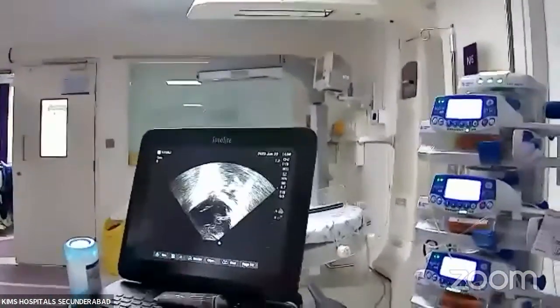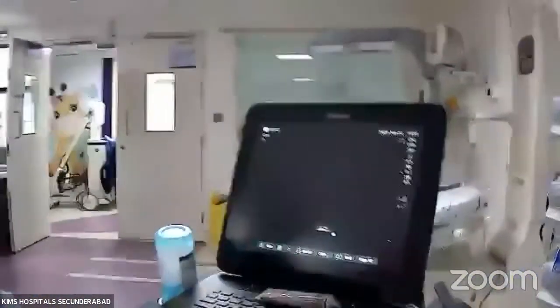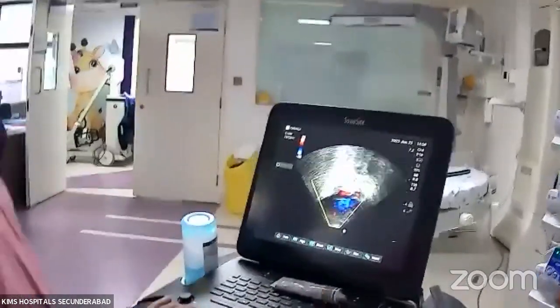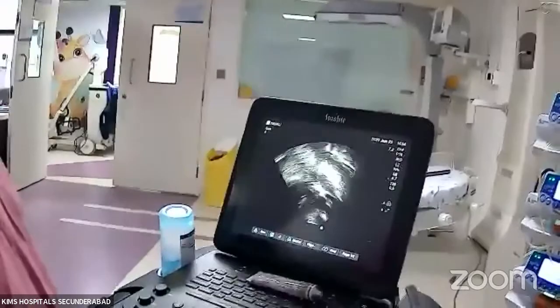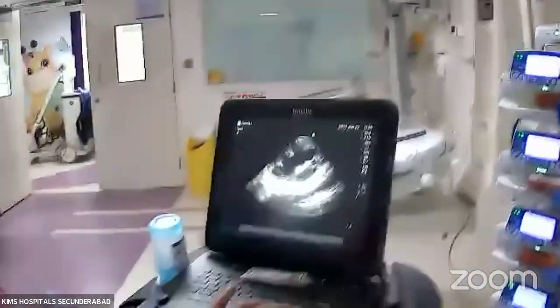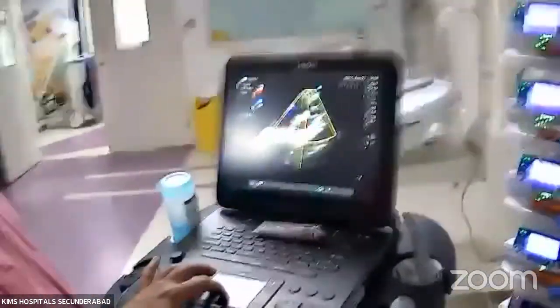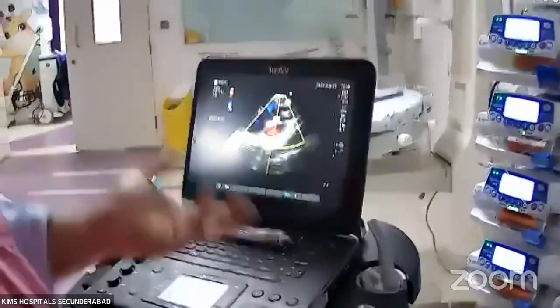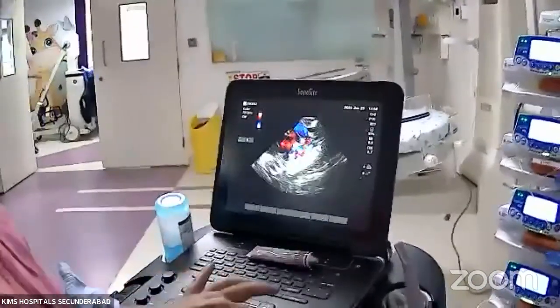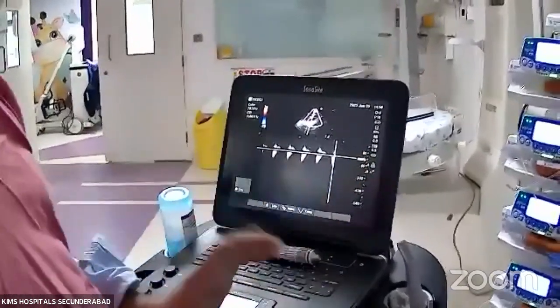Okay. And then, this is the first thing. Then this is fluid responsiveness we told, PA pressure we told. And if you get the PR, unfortunately here no PR, but if you see the PA directly, see this is the gradient, you can see this is the pulmonary artery, this is the PDA. If you see the PDA directly, it's a right to left, and that means the pressure is equal to the systemic or it's more than systemic. Otherwise, if you put a Doppler here, whatever pressure you get, the difference will give you the PA pressure. So this is the PA pressure.